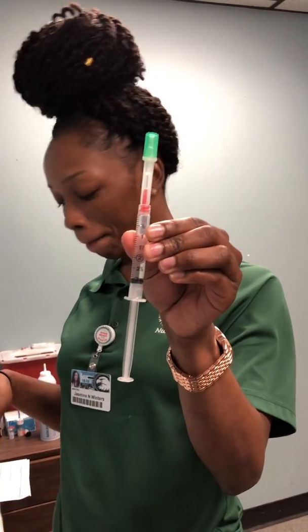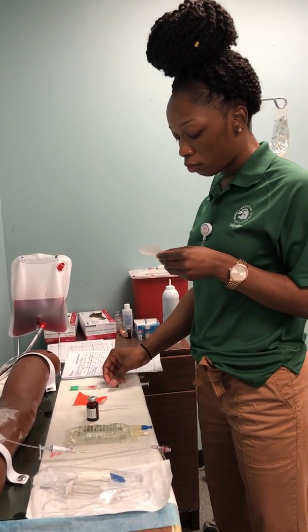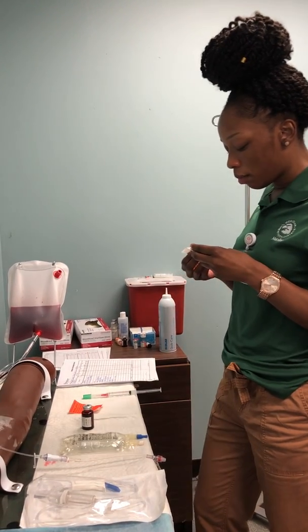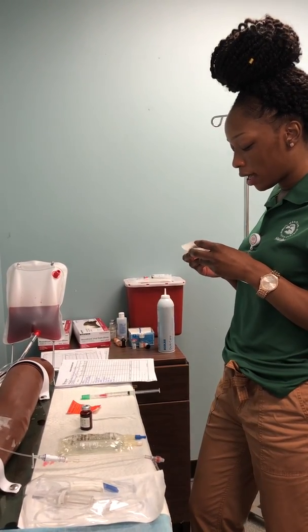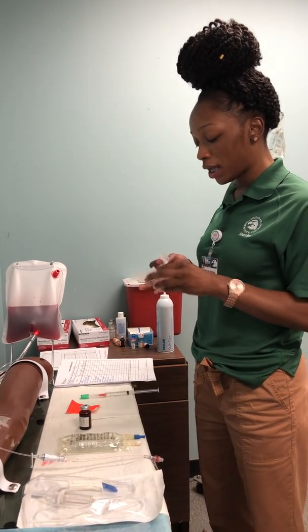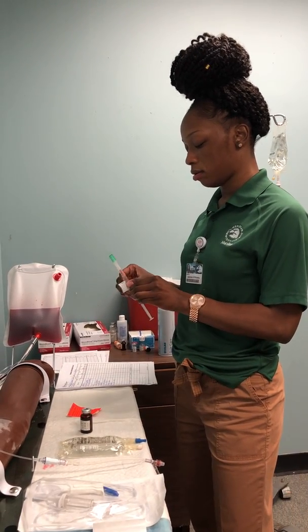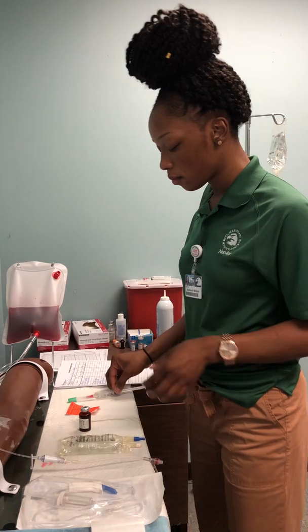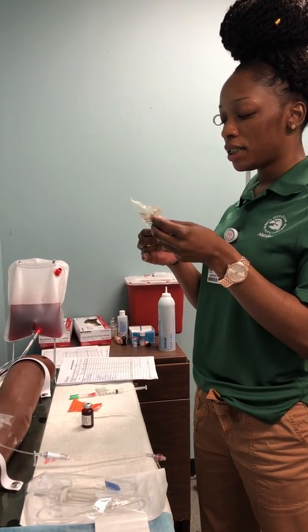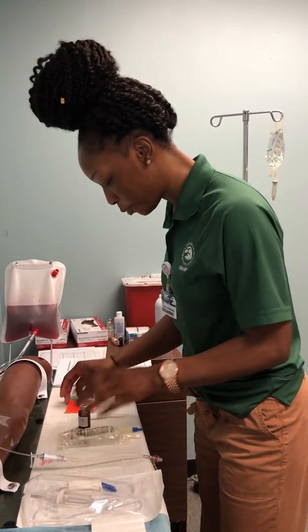3 milliliters. Okay, then I would label my syringe with the patient's name, the type of drug, the amount, the prepared date and time, my initials, and the expiration date and time. Then I would check my gentamicin for clarity and check the expiration date. It's clear and no segmentation.